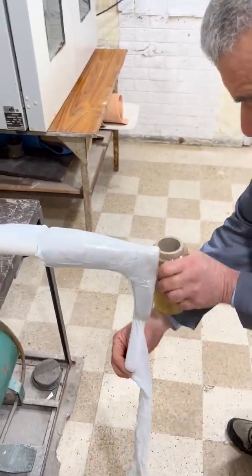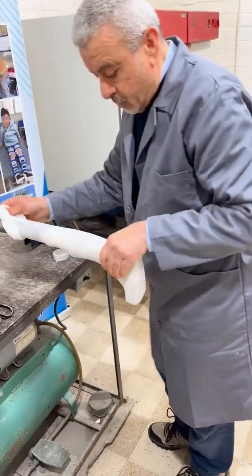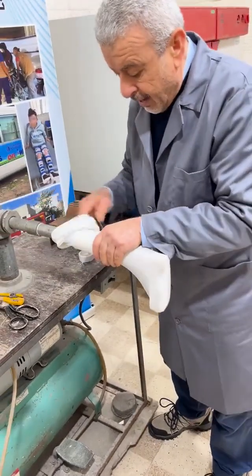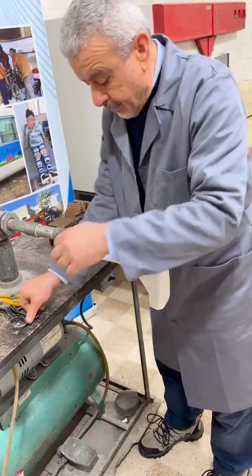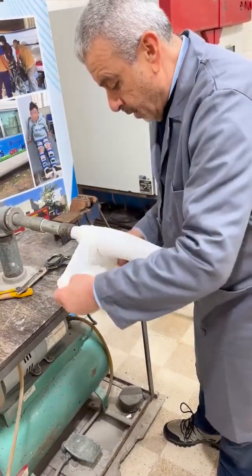Cut it from the bottom and then reflect it back like this. Make sure that you pull all the way, and then the extra we will cut there and tie it around here.